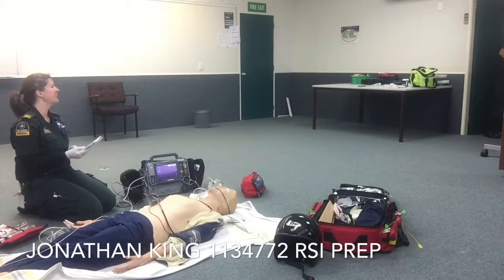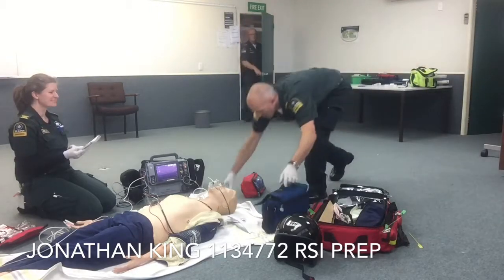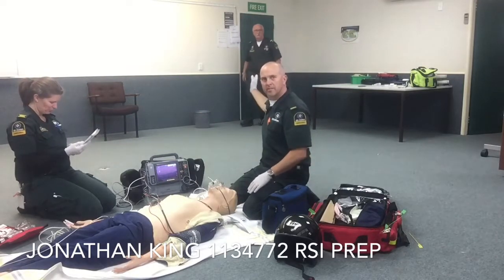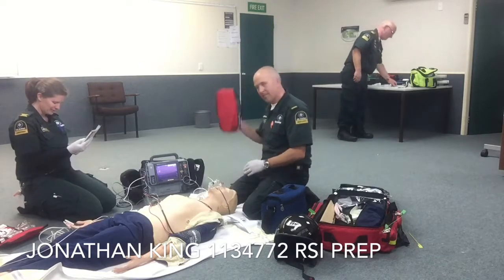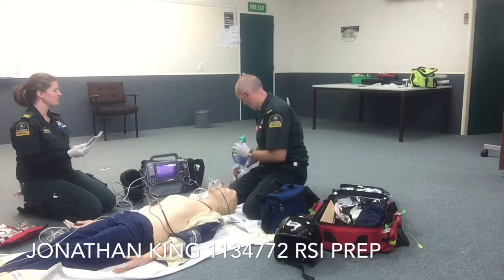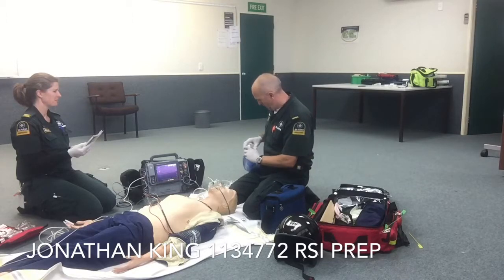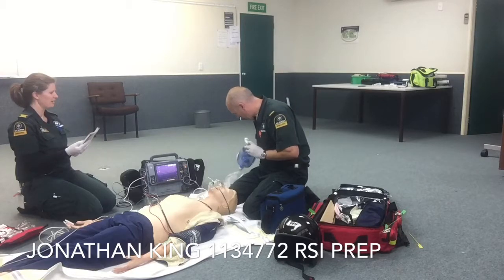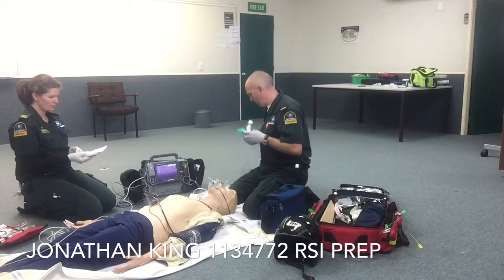Suction coming. Prepare a manual ventilation bag with PEEP valve attached. PEEP set to 5. Check.